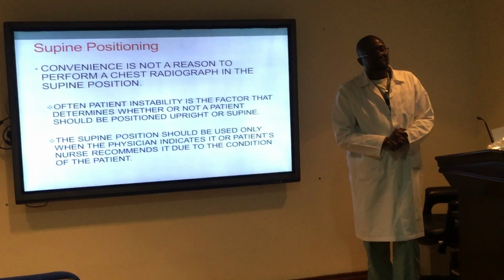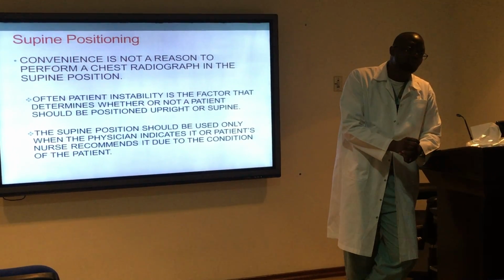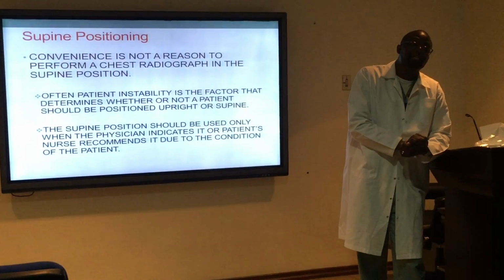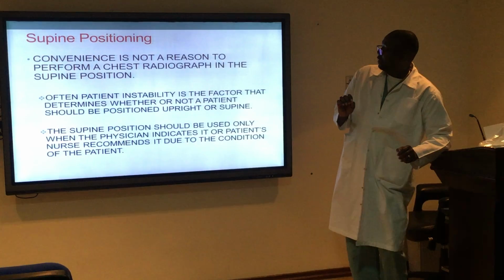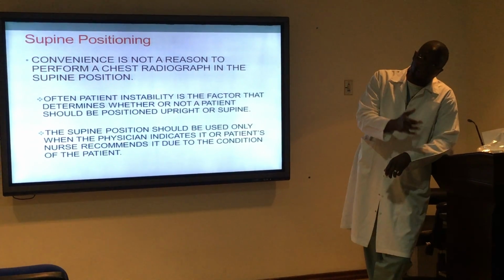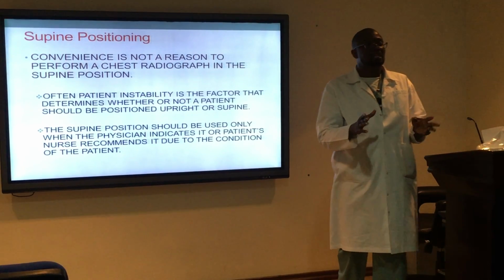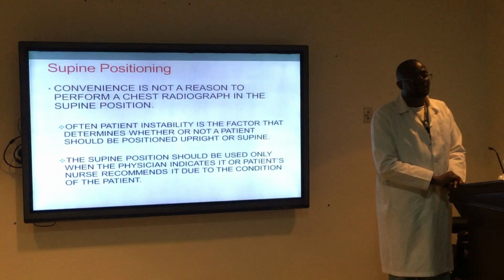Supine position. I just want to bring this to your attention. Convenience should not be the reason why you do your portable chest X-ray supine. No. Often, patient instability is the factor that determines whether the exam should be done upright or supine.